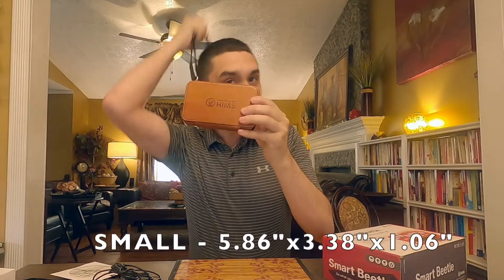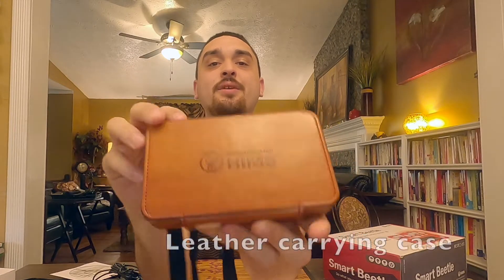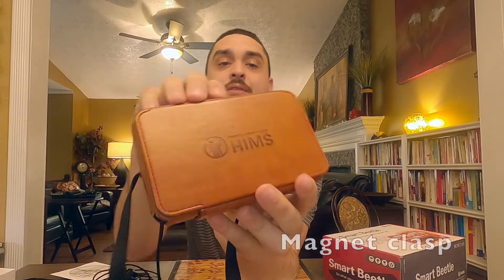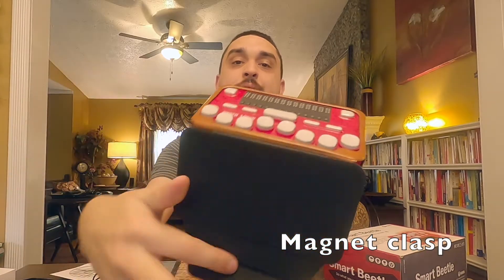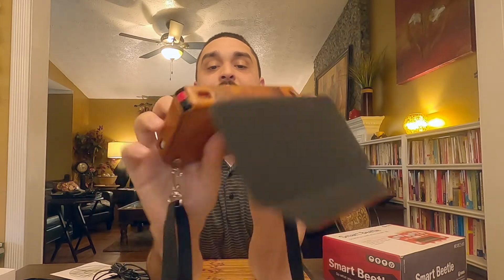You get the Braille Display that you can wear around your neck, and I really like that this one has a nice leather retro carrying case that it comes in. You flip the lid down and there's your Braille Display. I have this upside down.